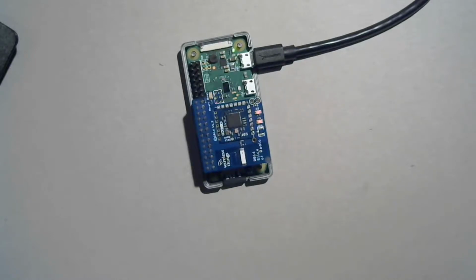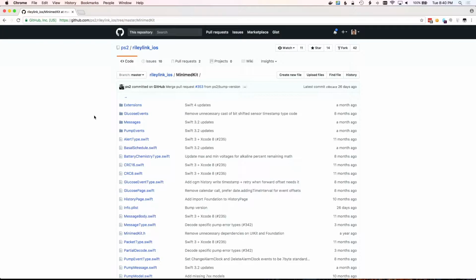All right, so one of the awesome things that I get to use is a body of knowledge and reverse engineering that has happened before me. And so what I'm going to do first is go look at the Riley Link mini med code. And this is all Swift code. I just realized I'm not presenting it. So this is all Swift code that someone has written, mostly Pete and Nate, Pete Schwamm and Nate Ratcliffe. They were the ones who built the original Loop app for the iOS devices that are out there. Riley Link is also a hardware module that Pete built. And he actually wrote the firmware that I'm using on this other chip as well. It's a generic communication for packet radio. So people have done all kinds of work ahead of me in all of this. And really, I'm just kind of standing on their shoulders at the moment.